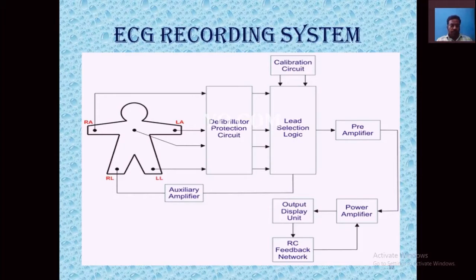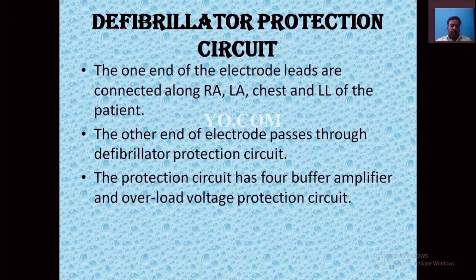Here in the ECG recording system we consider the lead system. Already we have studied the lead system in the previous session, so refer to the previous video. Next we are going to see each block description.